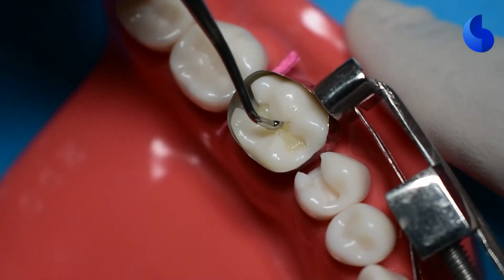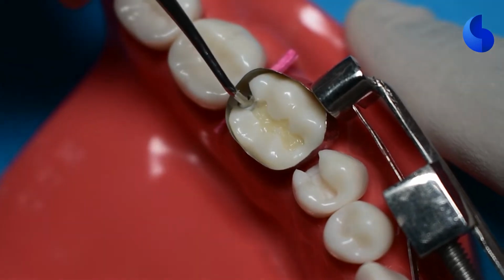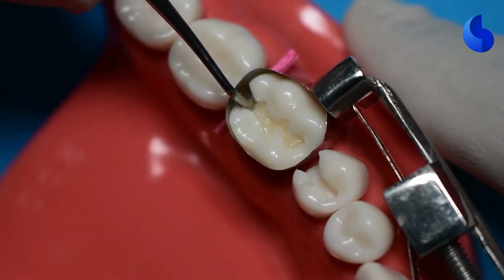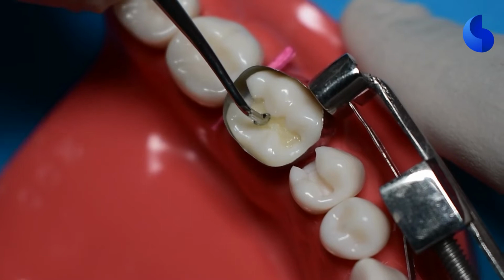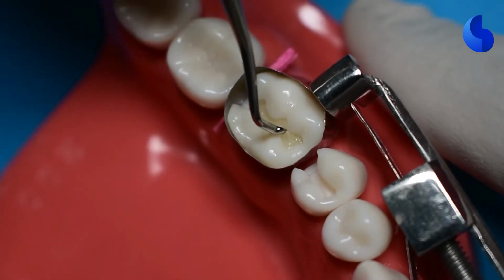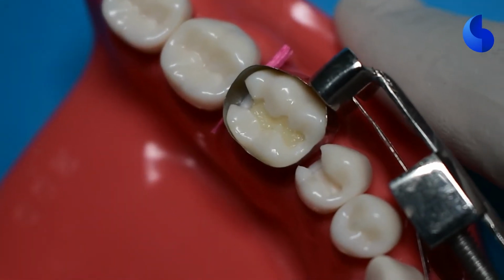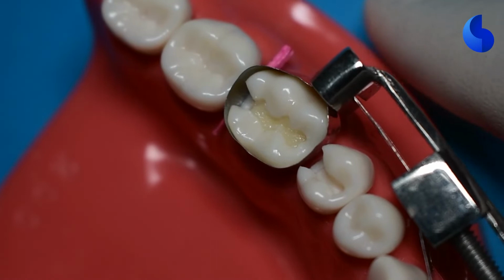So now we're using a cleoid-discoid carver to create some sort of an anatomy while you're condensing your first layer of composite. Composite cures in layers, so don't try to be hasty and don't try to fill it all at once and cure it at once. Instead, cure it in layers.